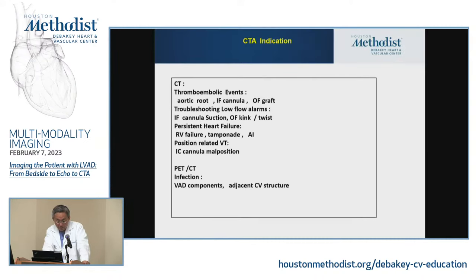So overall, for the CTA indication, when you have an LVAD patient with a thromboembolic event, I think it's a must to get a CT to evaluate the aortic root. Inflow cannula and outflow graft are less likely. But one thing that's very interesting, and some of my EP colleagues are here: in over 200, 300 CTAs we've seen, I've never seen any clot in the left atrial appendage, not even smoke. Well, I could have about one patient with smoke. That's it. It's quite intriguing.